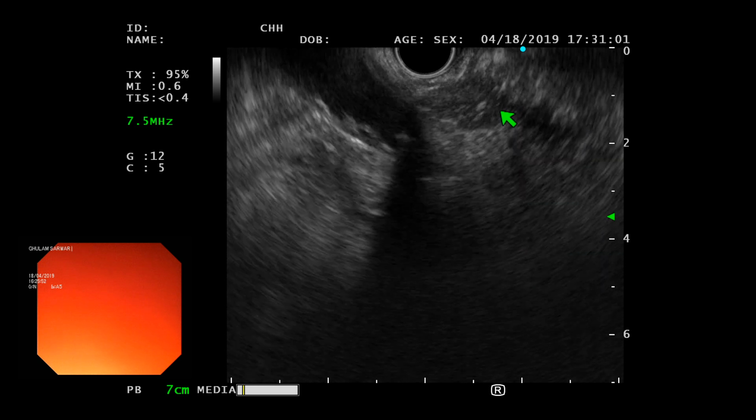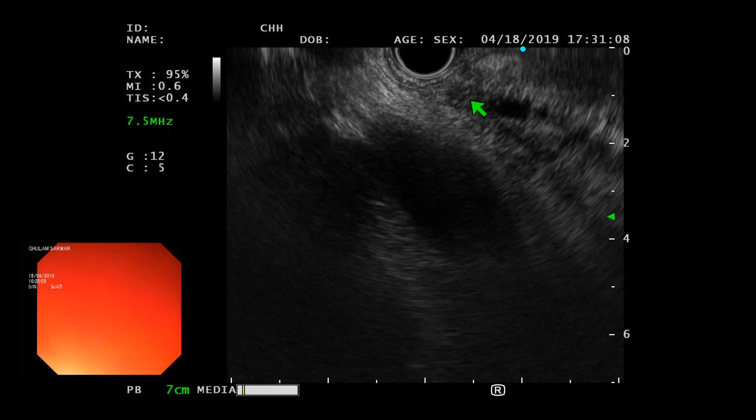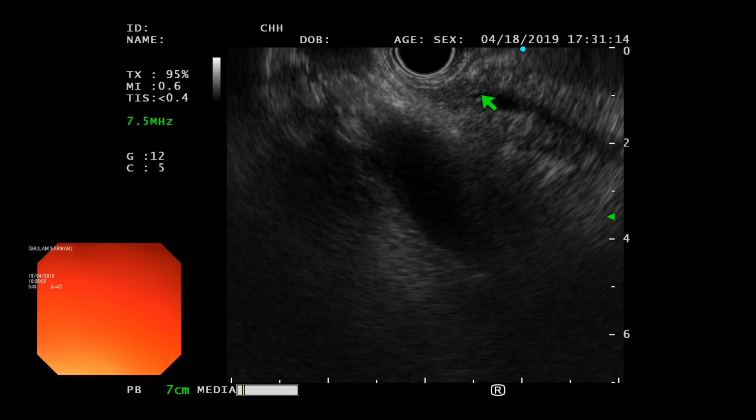Pancreatic duct, bile duct. Bile duct here, you can see all the way to the ampulla, right here in this pore. You see pancreatic duct, bile duct on top of it. So this is the ampullary area.